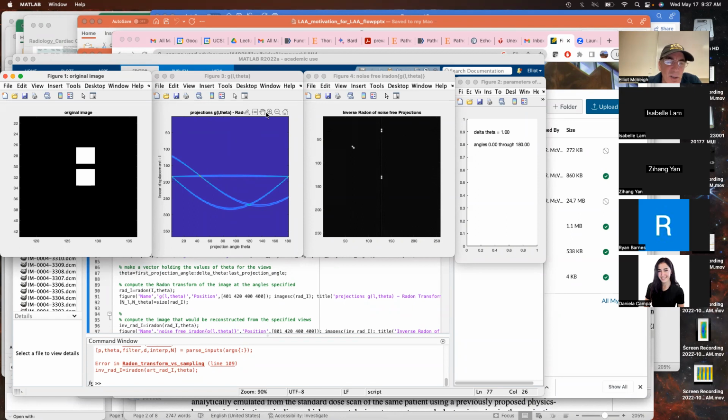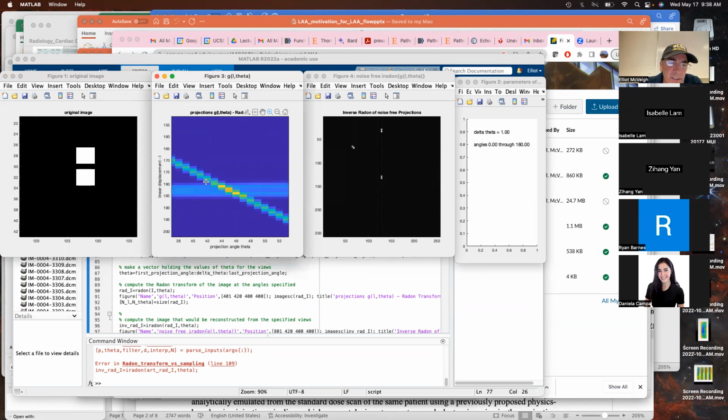Then this shows the sinogram for this data. We took 180 angles at 1 degree steps, so I have 180 points in this direction. And it looks like I have 360 maybe in this direction over here, which is our position along the detector. We can zoom up and take a look at some of these trajectories where it's crossing over here, so this box, or set of boxes, is crossing over this one at this point.